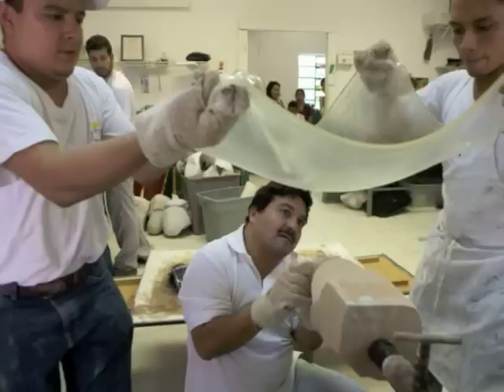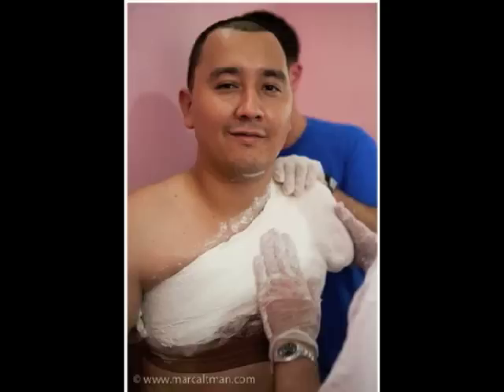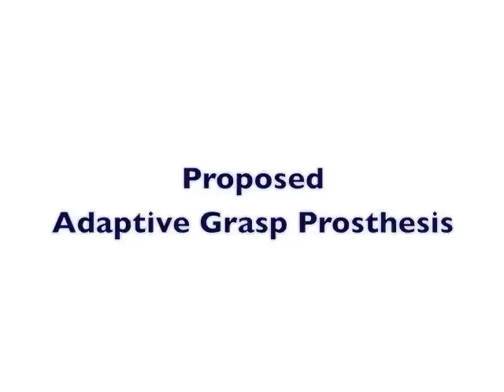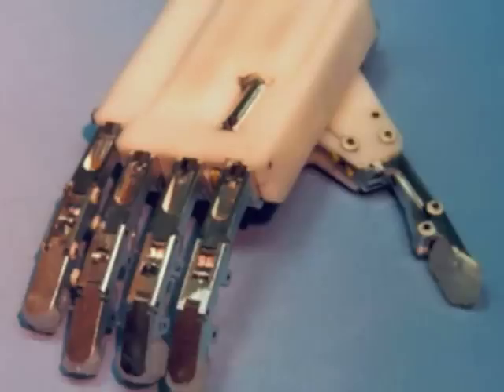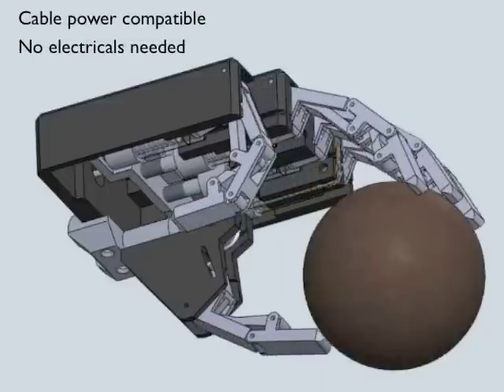If supplied with our advanced printing and scanning tools, these volunteers can produce world-class prostheses. By leveraging our design experience with the TBM hand, we will create a low-cost 3D printable version for deployment.